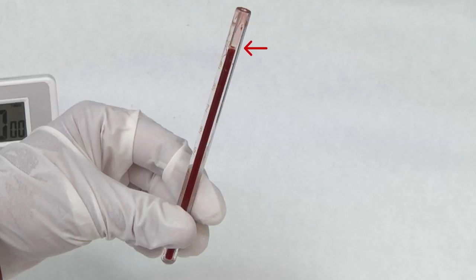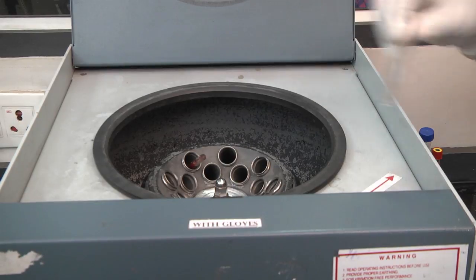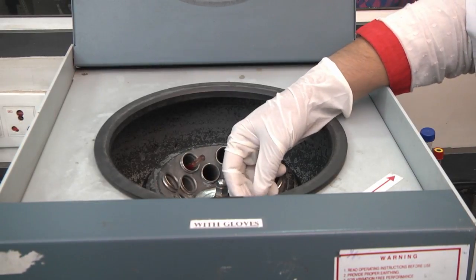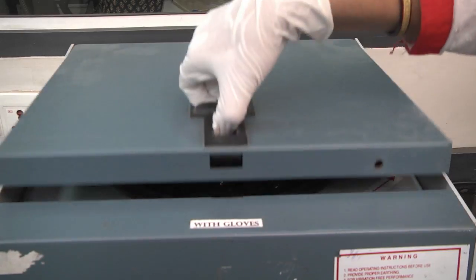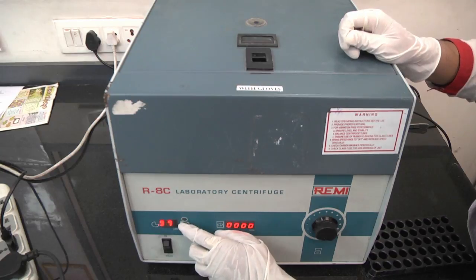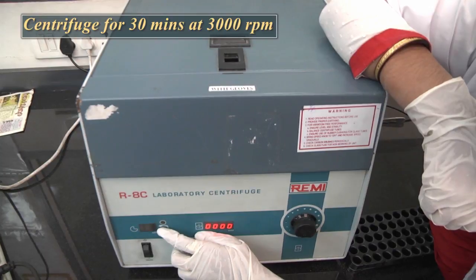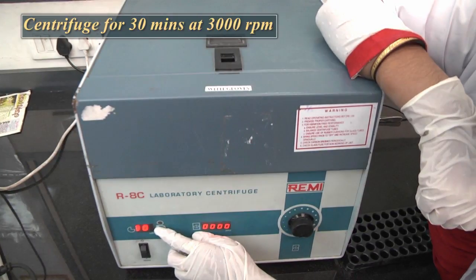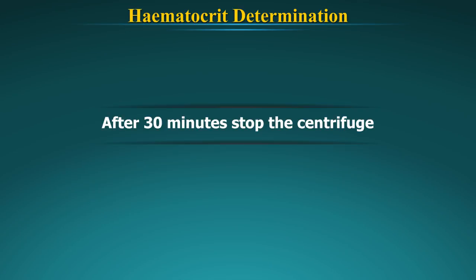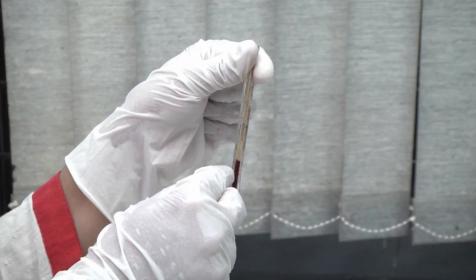There should be no air bubbles. Place the Wintrobe tube in the centrifuge machine, and place another Wintrobe tube filled with water on the opposite side to balance it. Turn the centrifuge on to slow speed and then gradually increase the speed. Centrifuge for 30 minutes at 3000 revolutions per minute. After 30 minutes, stop the centrifuge machine and allow it to stop by itself. Take out the Wintrobe tube and note the readings directly from the graduation.